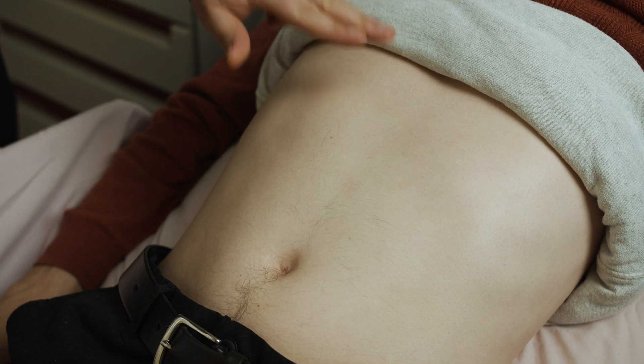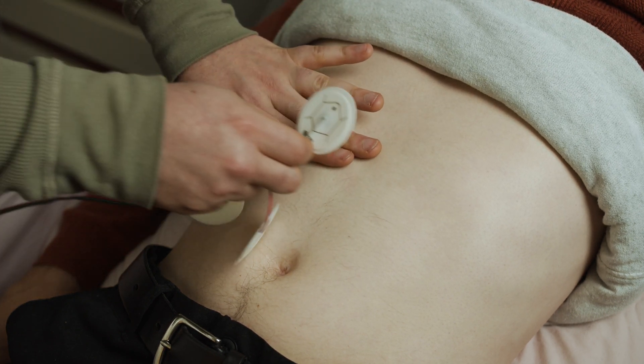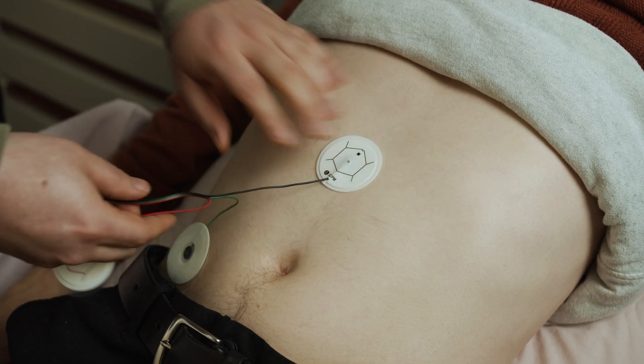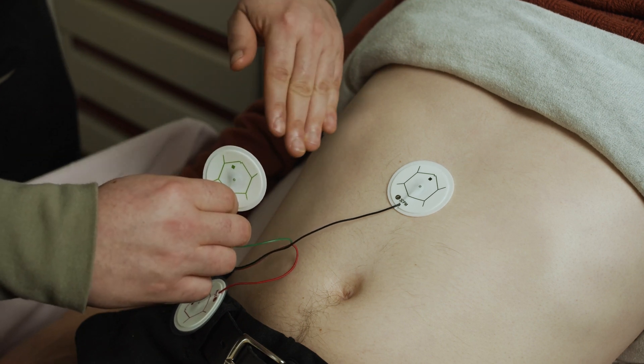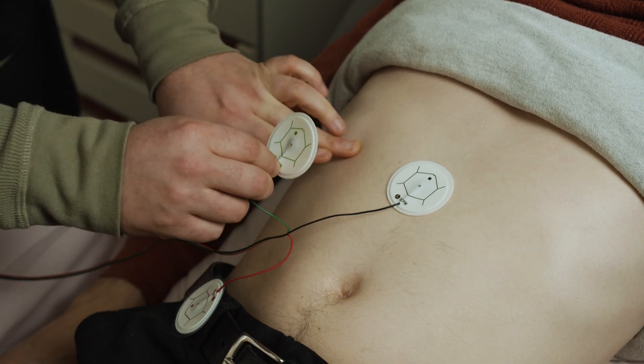The black lead will go midway between the umbilicus and the xiphoid process, as labeled on the electrode pad itself. The green pad will go mid-clavicular at the bottom rib, two inches below the bottom rib.